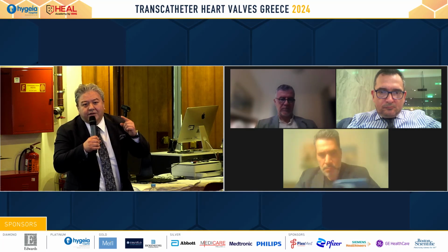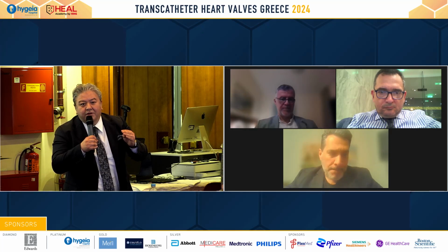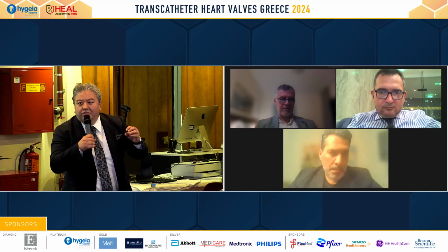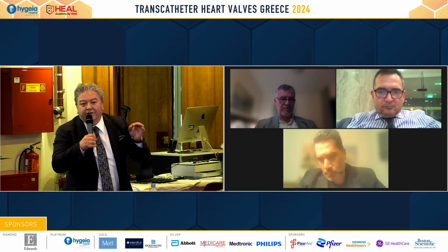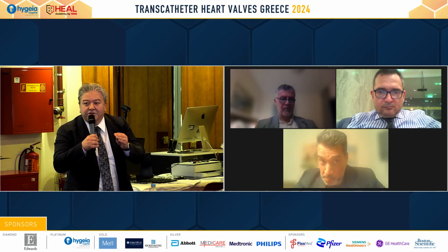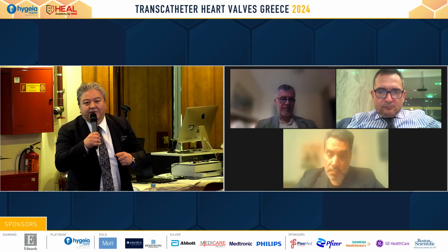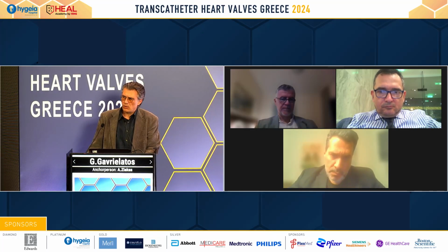I prefer to close that kind of PFO in not a regular way, maybe with transseptal puncture, because there can be even residual thrombus there, and during the passage of the PFO, there can be risk of arterial brain embolism. We know that kind of case, so my recommendation is to close that kind of PFO with thrombus burden and atrial septal aneurysm with transseptal puncture. But congratulations for the case. We tried that after 1 month under anticoagulation treatment, so we proceeded this way.